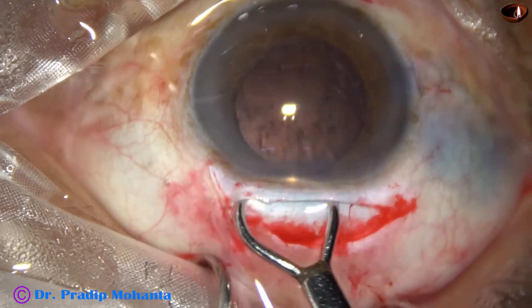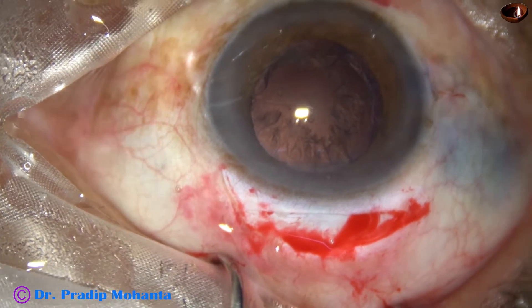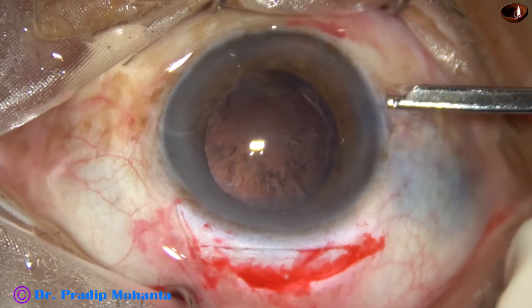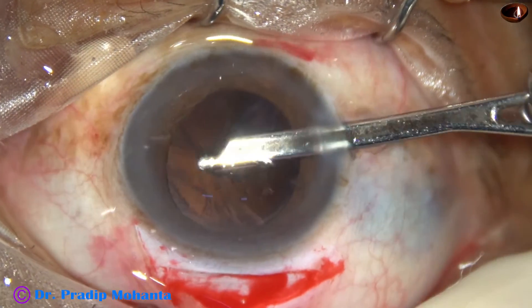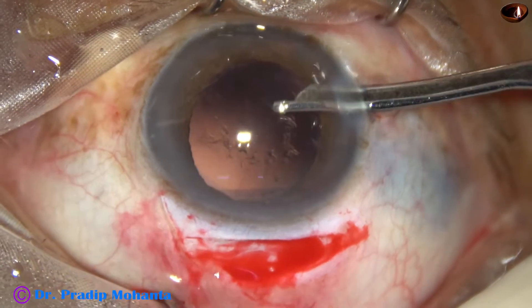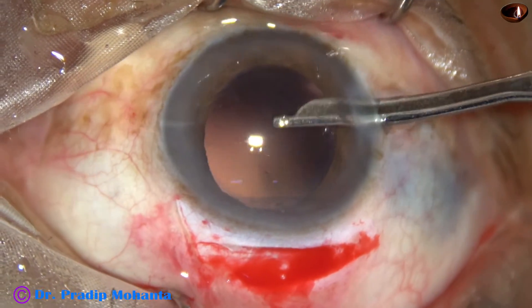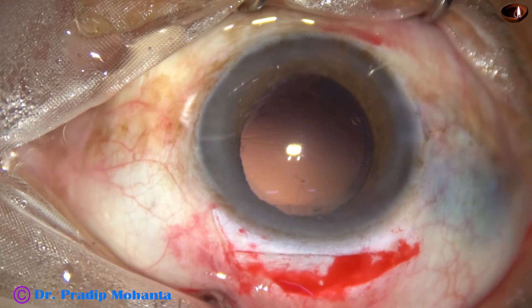To remove the cortex, we take the help of a Simcoe cannula. The Simcoe cannula goes through the side port — most of the cortex can be removed going through the side port, because the side port incision is smaller and the anterior chamber remains nicely formed. In this case, all the cortex has been removed through the side port using this 22-gauge Simcoe cannula.